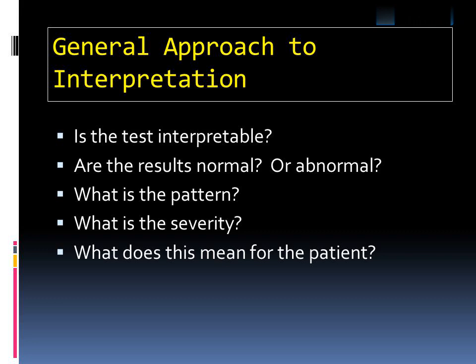General approach to interpretation. Is the test interpretable? Are the results normal, or abnormal? What is the pattern? What is the severity? What does this mean for the patient? PFTs cannot make a diagnosis, however, patterns can help narrow the differential diagnosis.